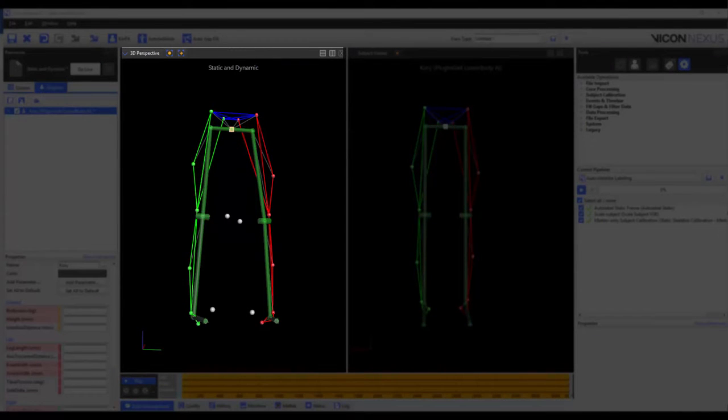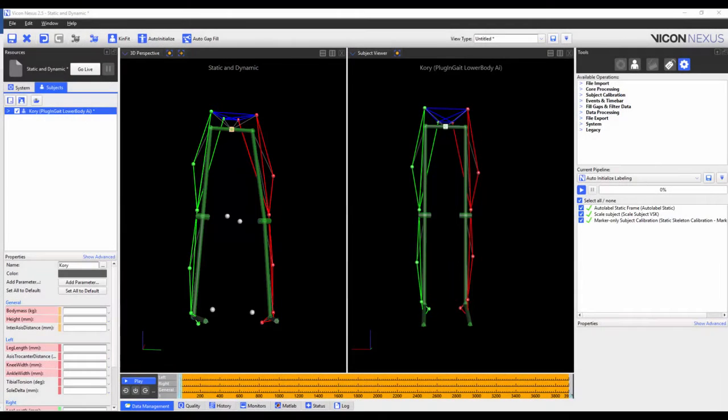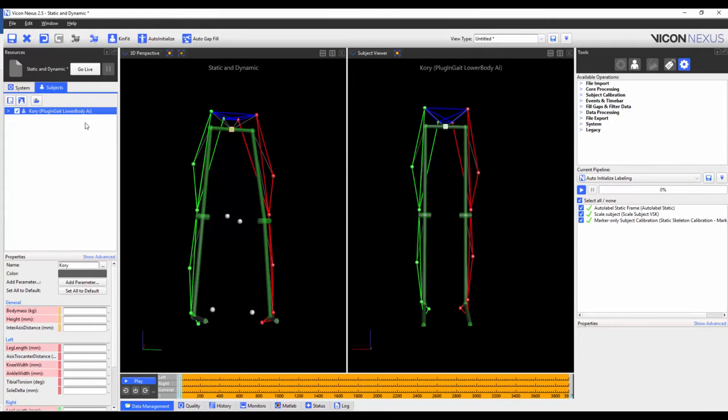We can also see that the segments and joints have appeared in the 3D perspective. Finally I'm going to save the subject and save the trial.